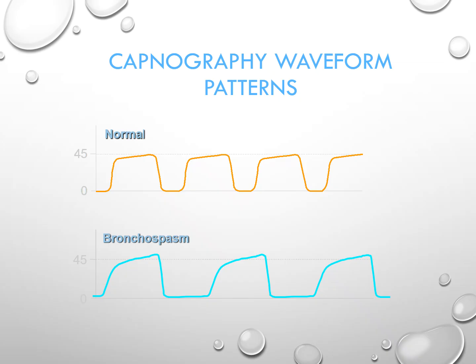Now, I'm not saying that you should look at the waveform and say, oh, that's a shark fin, this patient's definitely having an asthma attack. I kind of do the opposite. I determine that the patient's diagnosis is status asthmaticus. They needed to be intubated. They're on steroids. They're on Heliox. And at the same time, we happen to see a classic shark fin depiction on the capnograph.